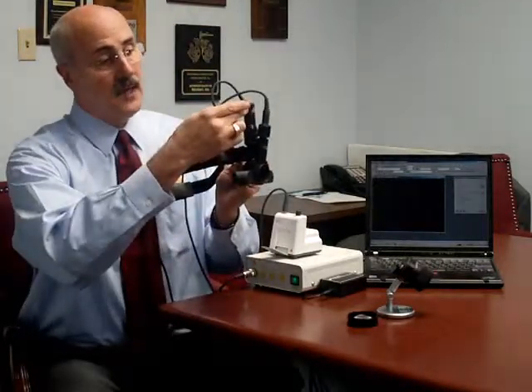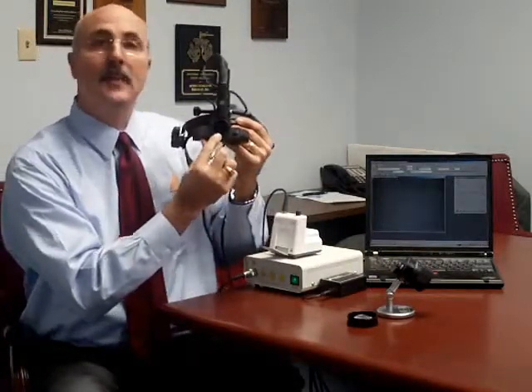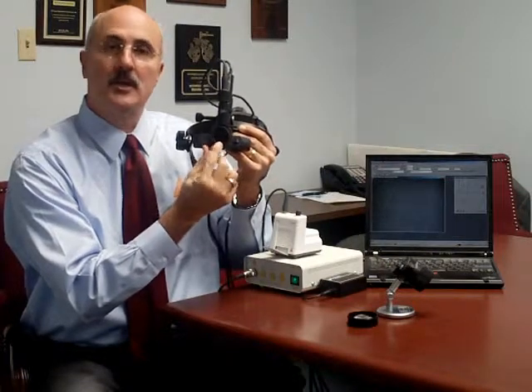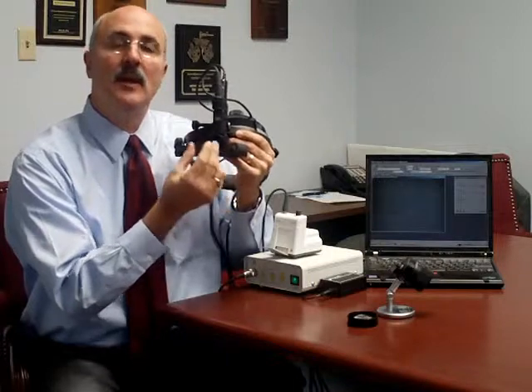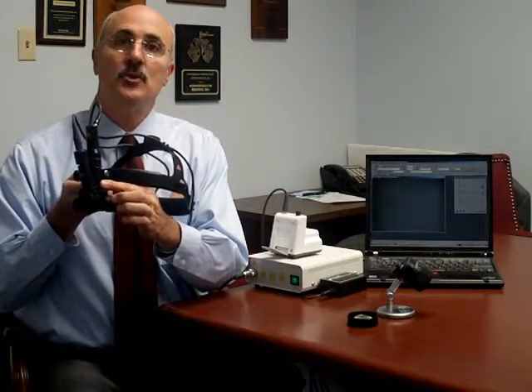The video camera located here has a video pickup located right between the left and right oculars, so that the camera is seeing exactly the same image that the user of the instrument is seeing. In addition, there is a focus control knob here on the side that allows you to adjust the focus for different working distances of different operators.